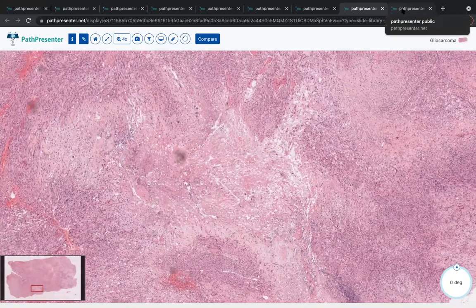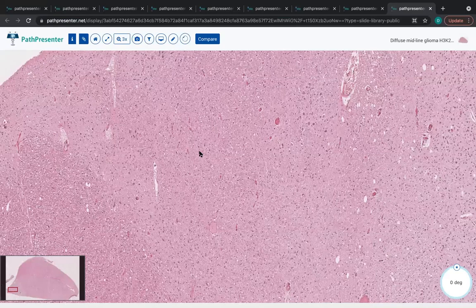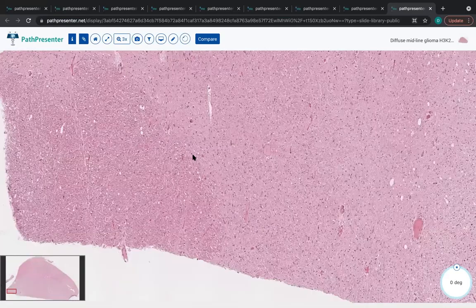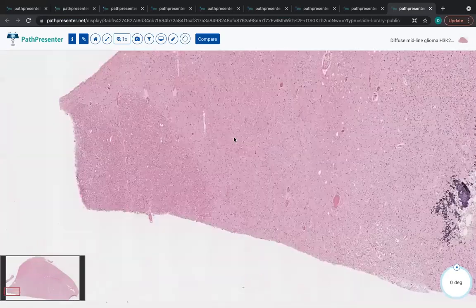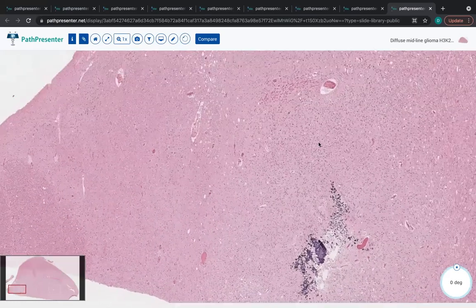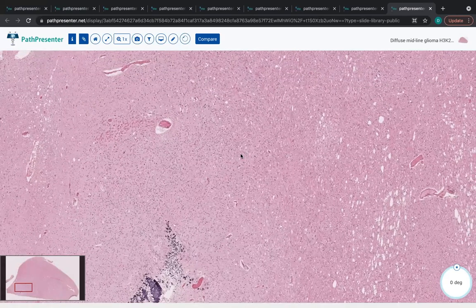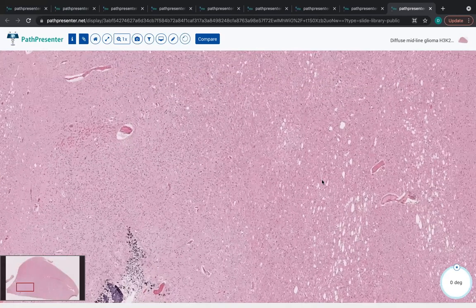Okay, we've recently been handed another grade 4 glioma diagnosis that came into being in the 2016 WHO and has since been refined a little bit. This is, of course, a diffuse midline glioma, a histone mutated high-grade infiltrating glioma.